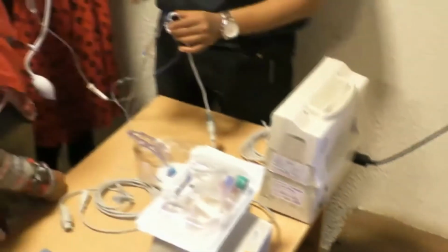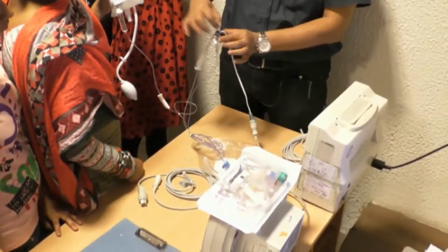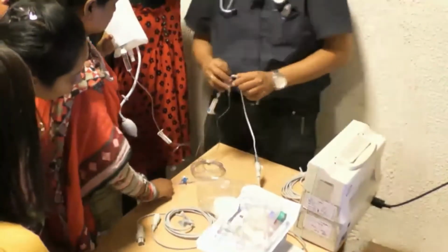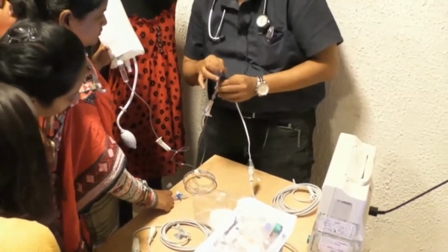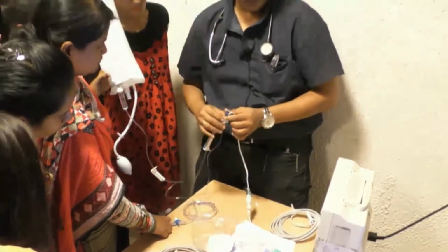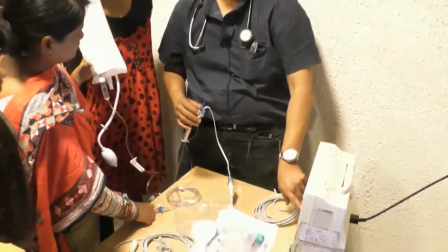The same way you flush the arterial line with the tap, you give a sharp pull to it, and people try to watch the waveform. There was a fast rise, then flat on the baseline.